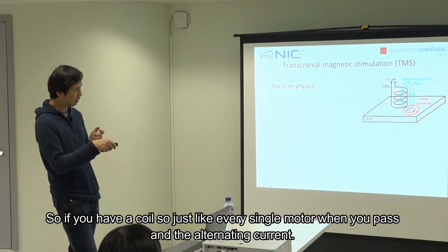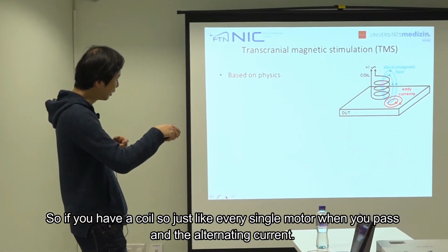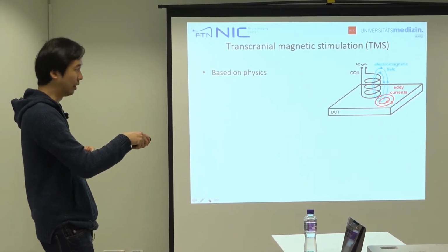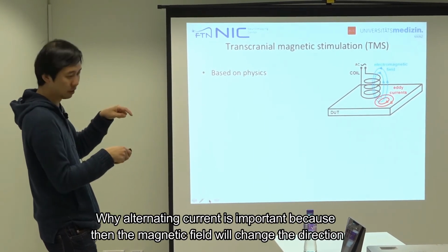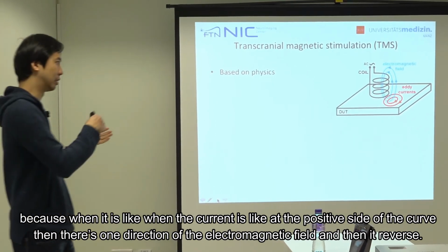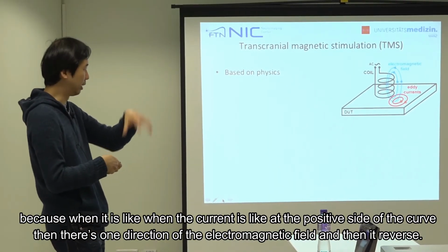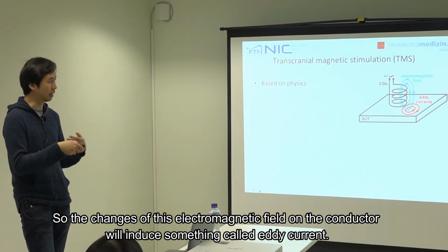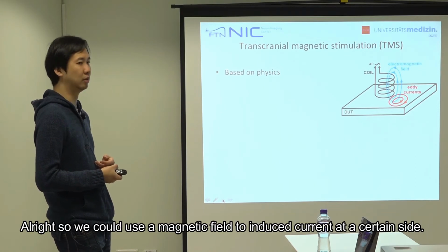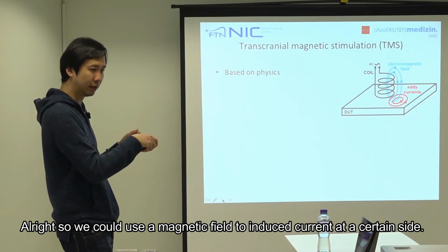So if you have a coil here, just like every single motor, when you pass alternating current, then you could generate some kind of electromagnetic field by this coil. And why is alternating current important? Because then the magnetic field will change direction. When the current is at the positive side of the curve, there's one direction of the electromagnetic field, and then it reverses. So the changes of this electromagnetic field on a conductor will induce something called eddy current. All right. So we could indirectly use a magnetic field to induce current at a certain site.